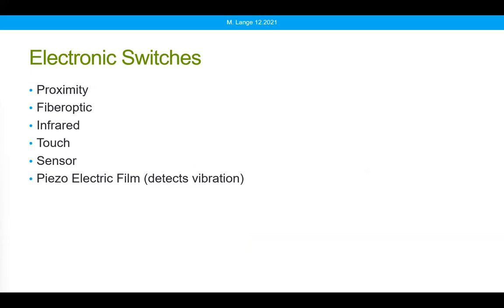So before we get into electronic or electrical switches, we have a couple questions here. Aaron has said, are there any switches that have a louder feedback for hearing impaired people? So if someone's having difficulty hearing the switch, either because the click just isn't there, like an electronic switch, or it's not within someone's hearing ability and they really need that feedback, you have a couple options.